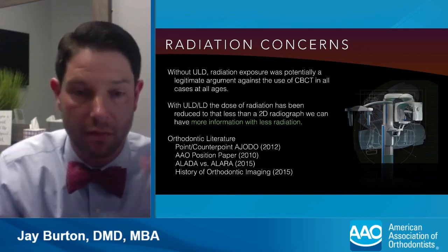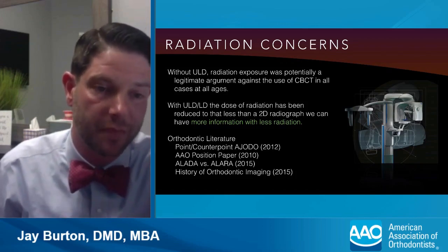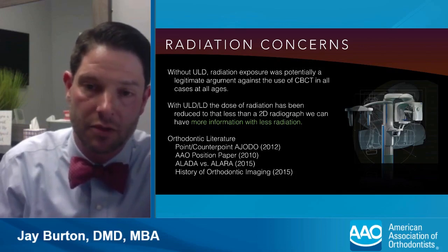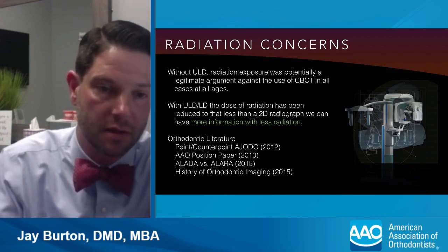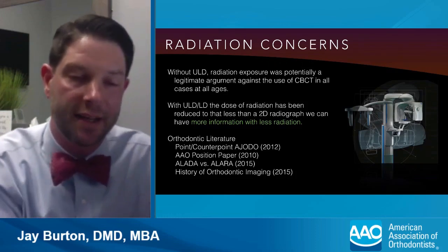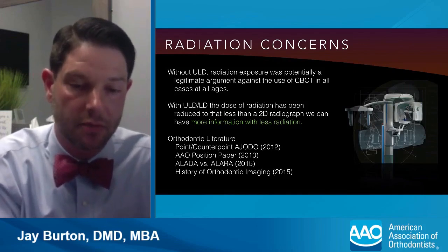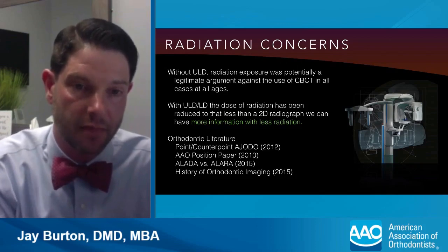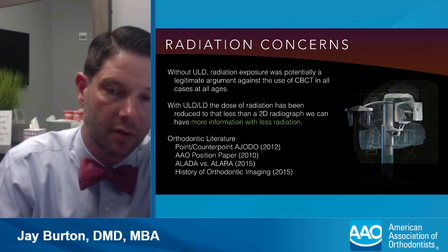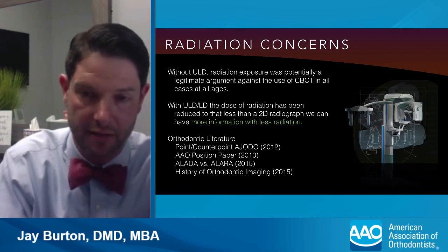The newer machines that are out there, most of the better companies have figured out how to do ultra-low dose imaging. And to some degree, it's a matter of settings. Just lower the mA and lower the kVp and lower the amount of time the patient's exposed. But the behind the scenes part of it is really the algorithms necessary to process all the images that are taken and combine them into a CBCT volume. So we're going to look at a couple of pieces of literature here to discuss some of that information.